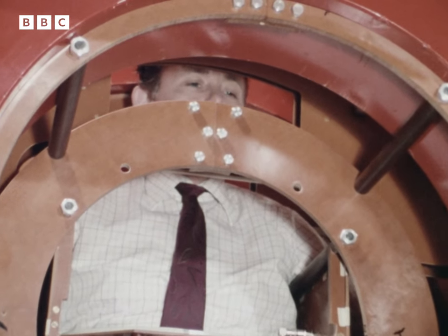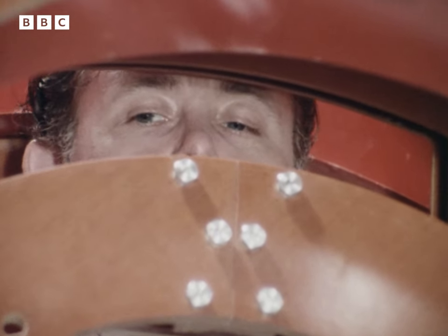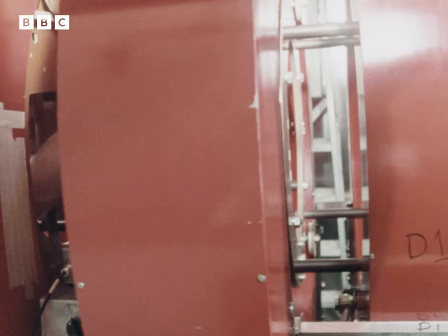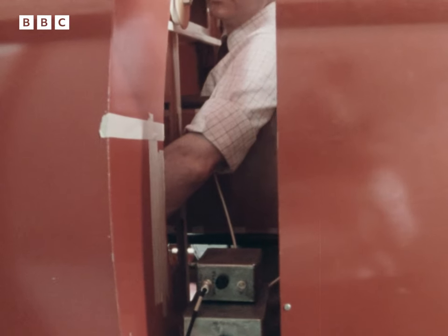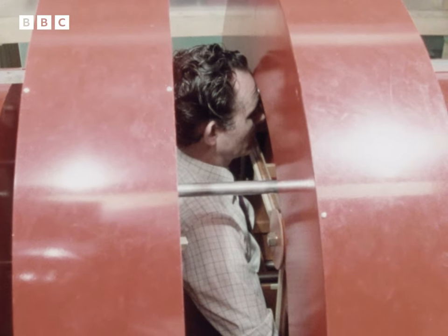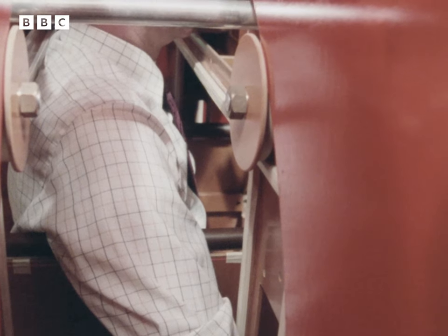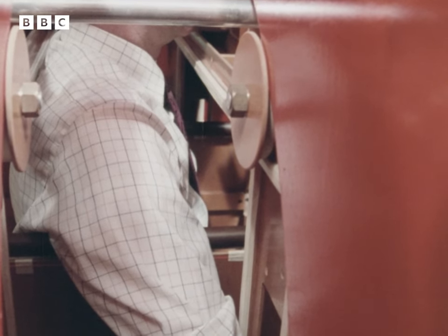Dr. Mansfield feels nothing. The machine consists of four large electromagnets. They produce a huge magnetic field, which passes right through the body. At the target area, there's a smaller, separate magnetic field, which is used as a three-dimensional grid, allowing minute areas of tissue to be pinpointed exactly.